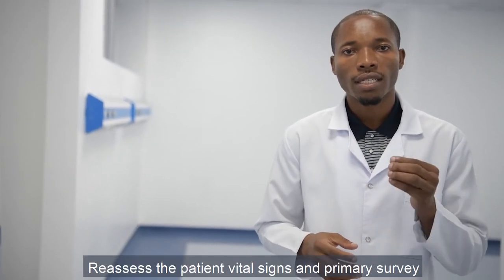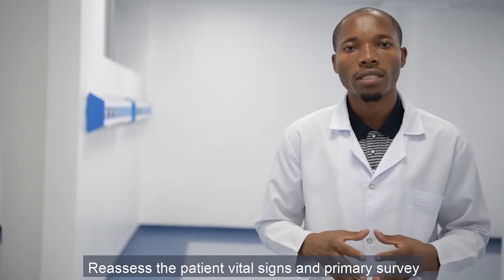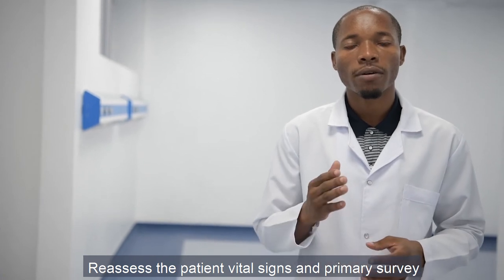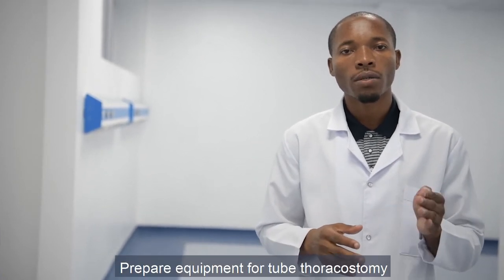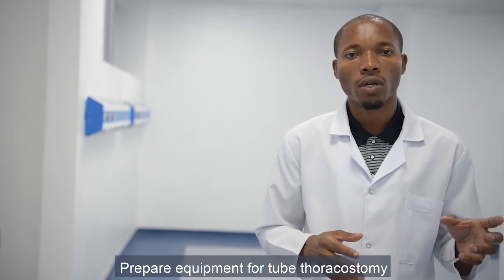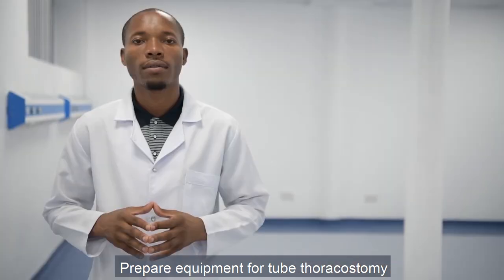Reassess the patient's vital signs and perform a primary survey. Prepare equipment for tube thoracostomy.